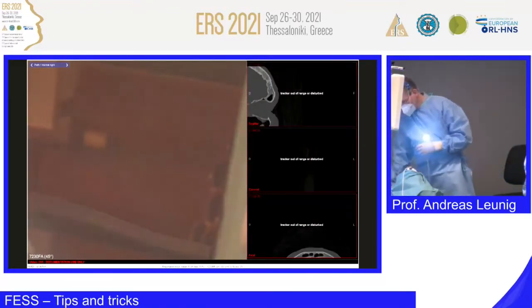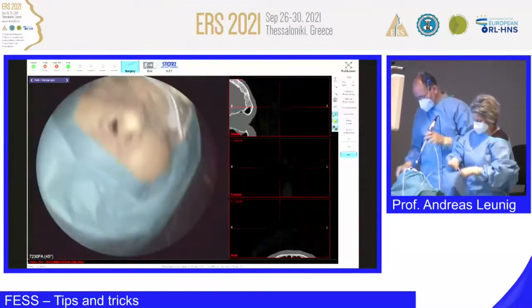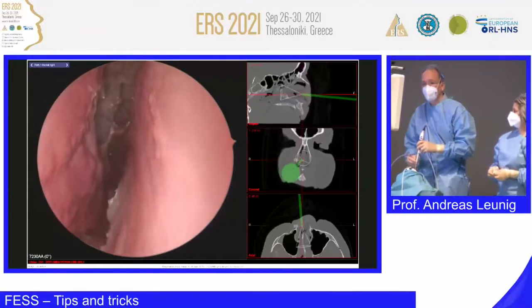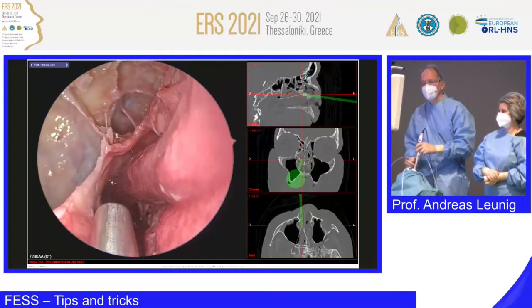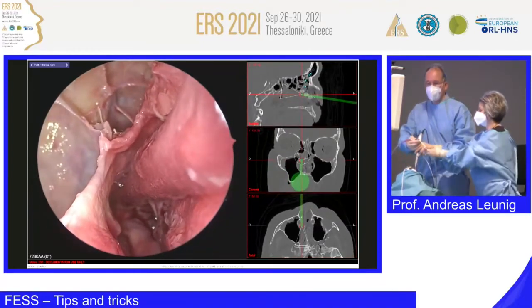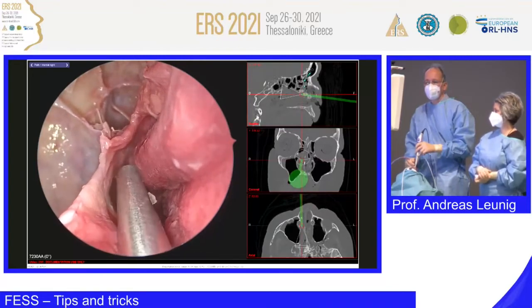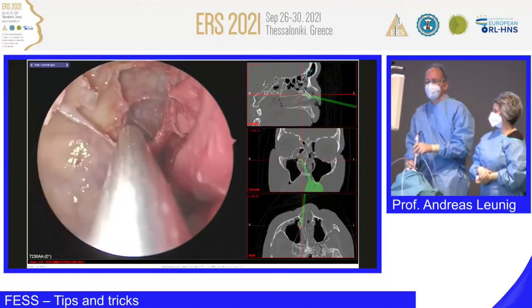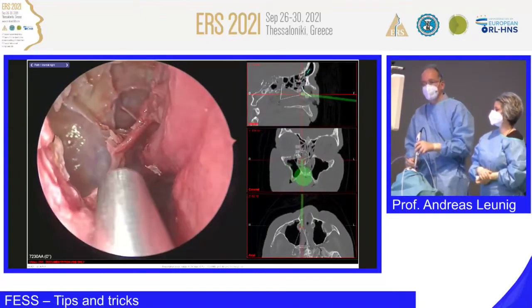Now, in case of a posterior nasal bleeding, there's a good way to handle this by looking for the sphenopalatine artery, the foramen and the artery. There are usually four locations where a spurting vessel can occur. First of all here, when you enlarge the maxillary sinus ostium inferiorly or posteriorly, or you resect a concha bullosa, and you have at the end of the posterior third of the middle turbinate an artery, a branch of the sphenopalatine artery, or you have some arteries in the posterior part of the nose around the sphenoid sinus ostium, the inferior part, and this can be the source for arterial bleeding, which can be not very nice.